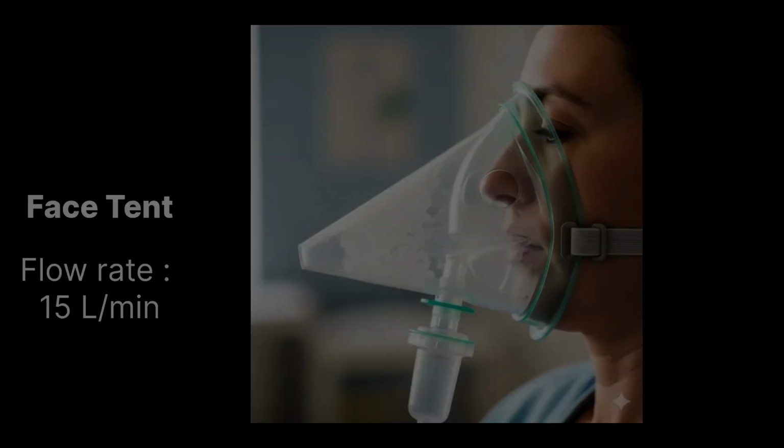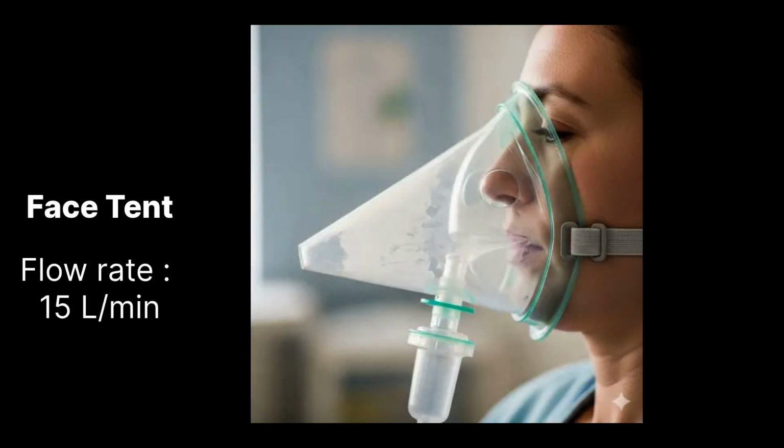Finally, we have a face tent, a cone-shaped mask that rests over the patient's face. Flow rate high, usually over 15 liters per minute. Use: this device is great for patients with facial trauma or burns who can't tolerate a regular mask. It also provides high humidification.